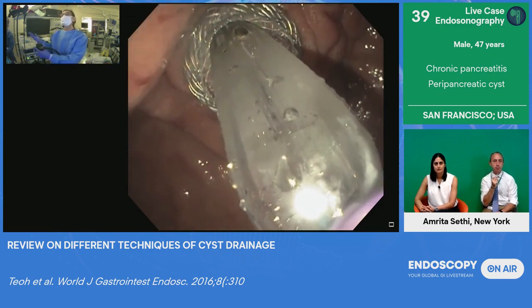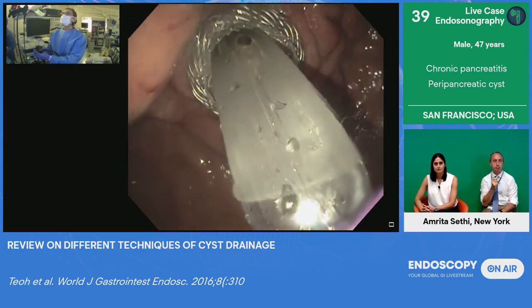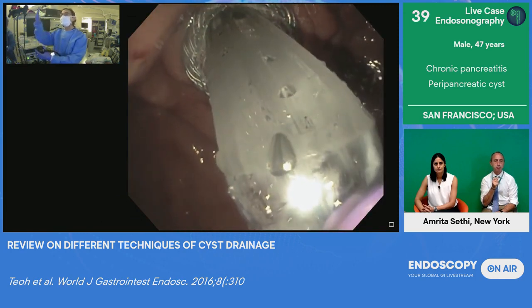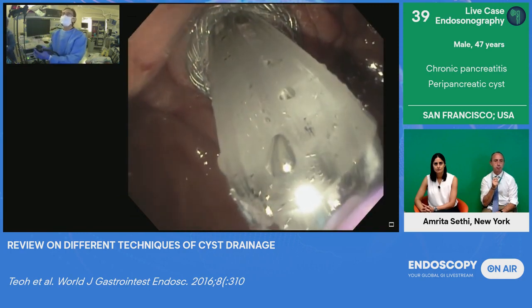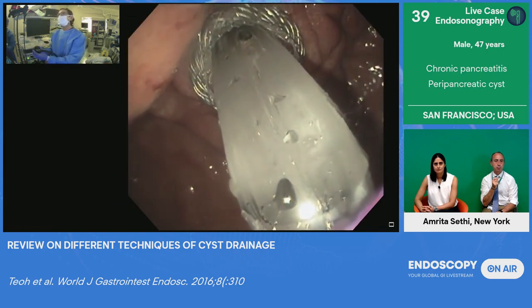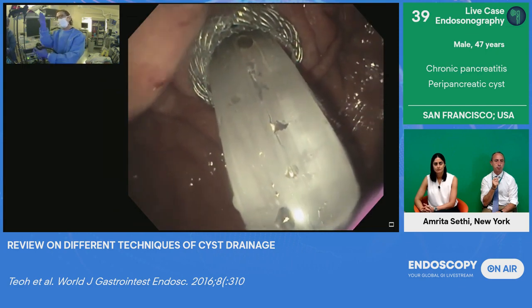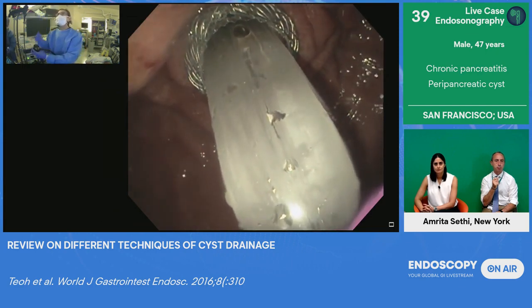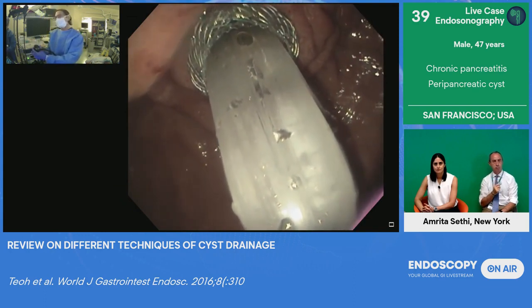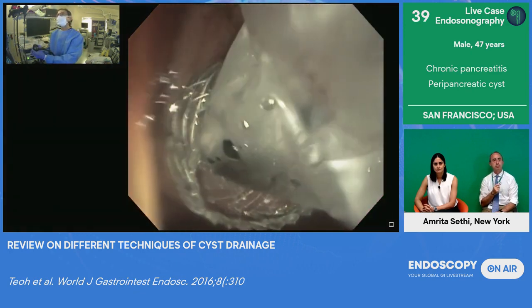Now, when you dilate up to 15, it's not really going to be 15. And in those cases where I really need to get optimal drainage, I might even go a little higher. So I'll pick a 15 to 18, but this is fine for now. All right, and now go to 15. So that'll be the full. So it's all under direct visualization, good position. And when it's up to 15, I deflate, go down, and then we're gonna look again and pull out very slowly.